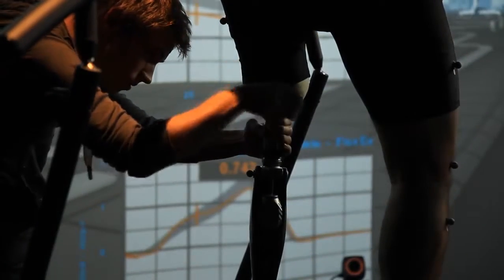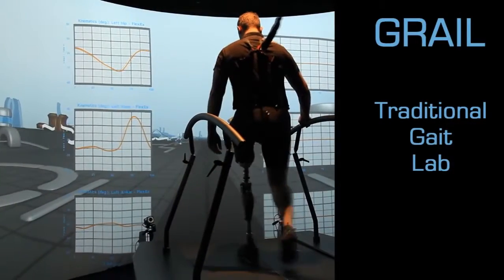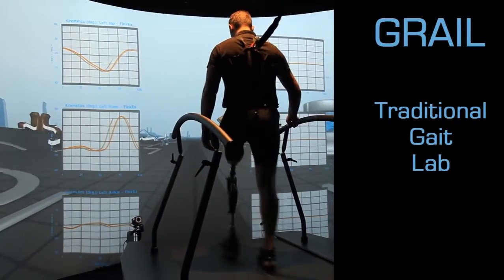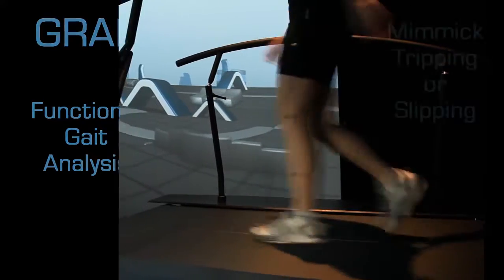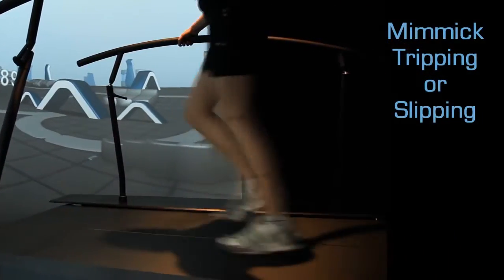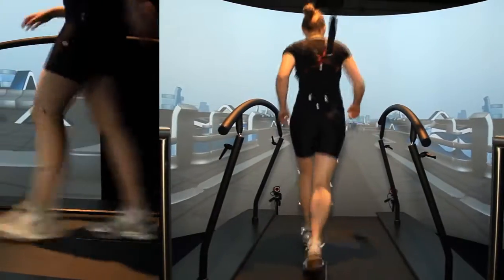GRAIL is useful for dynamic alignment of prostheses. All the functionality of a traditional gait lab is available with GRAIL, but for the first time you can also perform a functional gait analysis by measuring responses to perturbations, mimicking tripping, slipping, or medial-lateral belt translation.